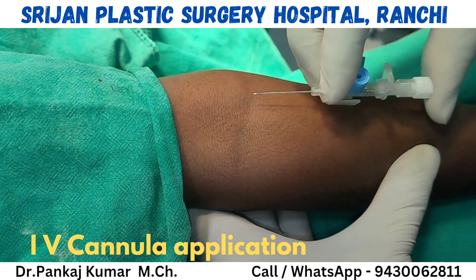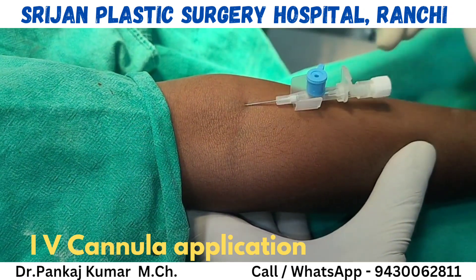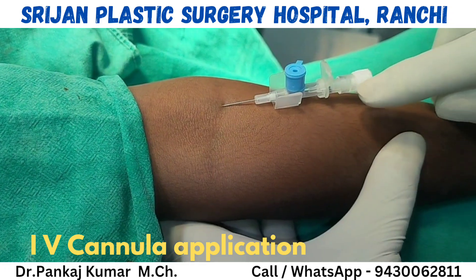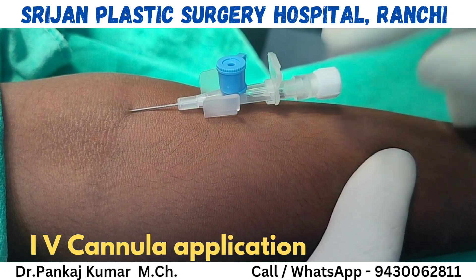Now going inside the vein. We can see that in the back of the stylet, blood is coming out — blood is visible there, confirming we are in the vein.